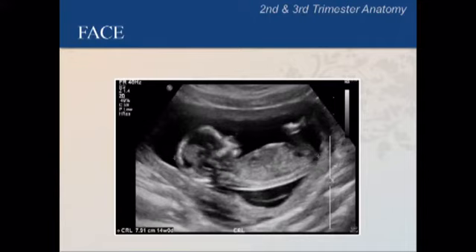Which features of the head and body can you clearly identify? Please pause the video now to encourage responses from the group. Here we have labeled the skull, forehead, nose, body, spine, and leg to make them more obvious.